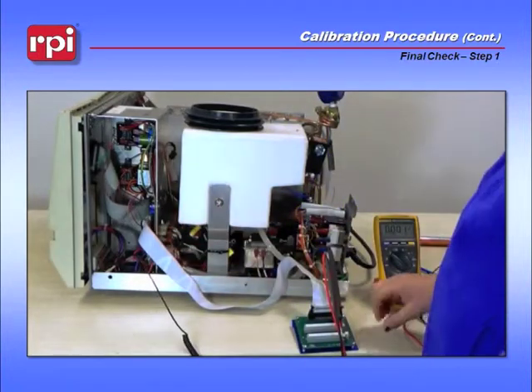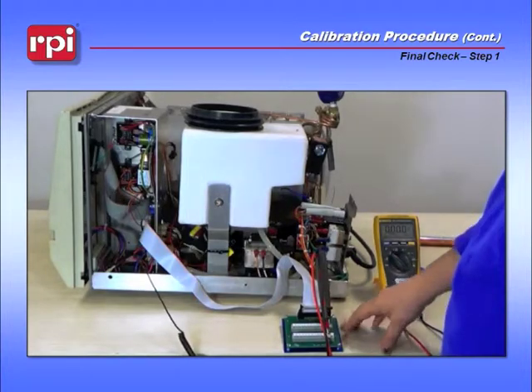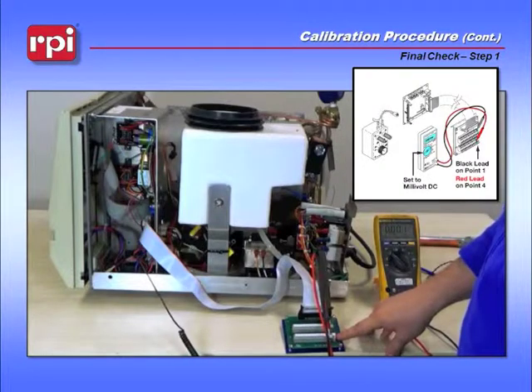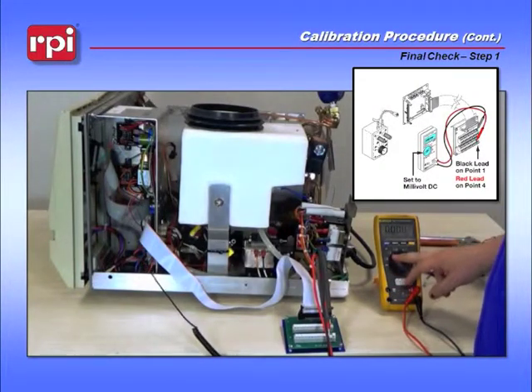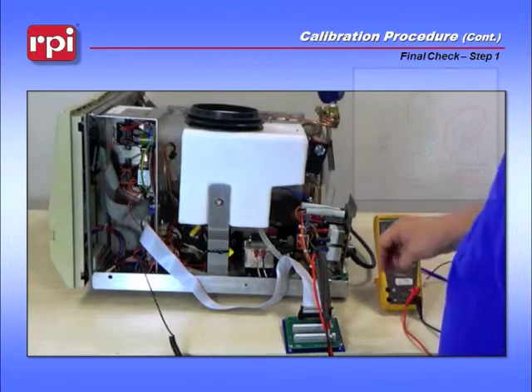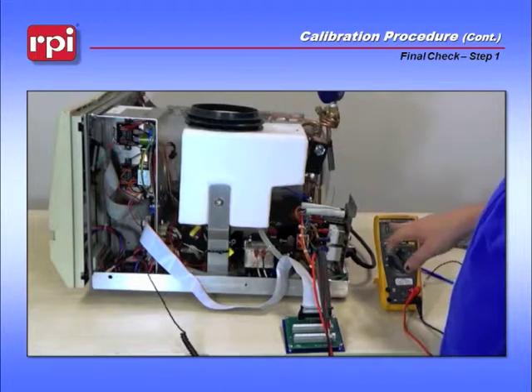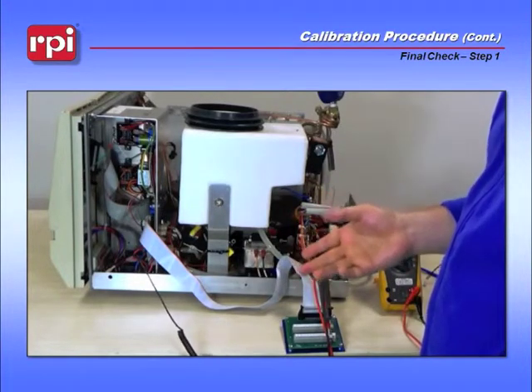Once you've reconnected it, leave your test point board connected. Leave your meter leads with the black lead on test point 1 and the red lead on test point 4, and set your meter to volts DC scale. That way, as the machine goes through the cycle, you can see the 500 millivolts rise to 1.5 volts at 30 psi as it should be.